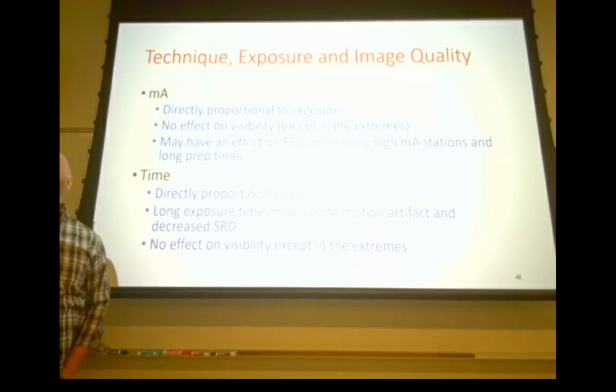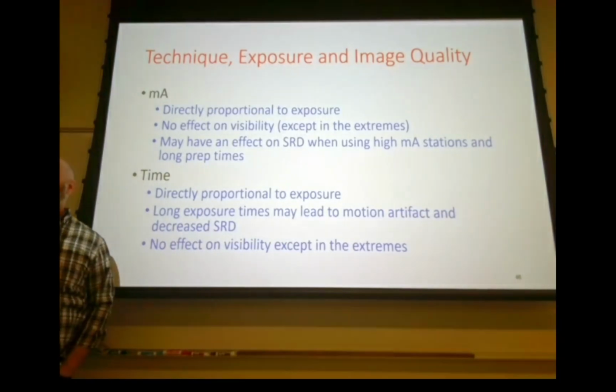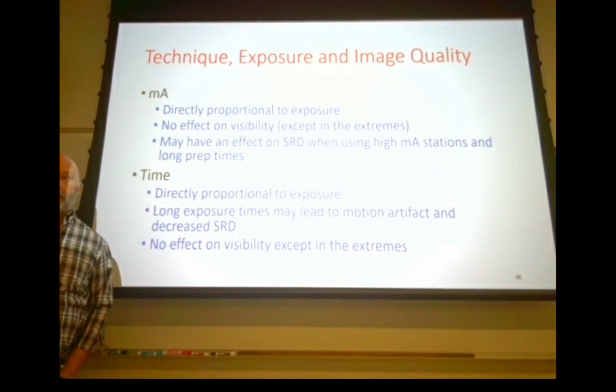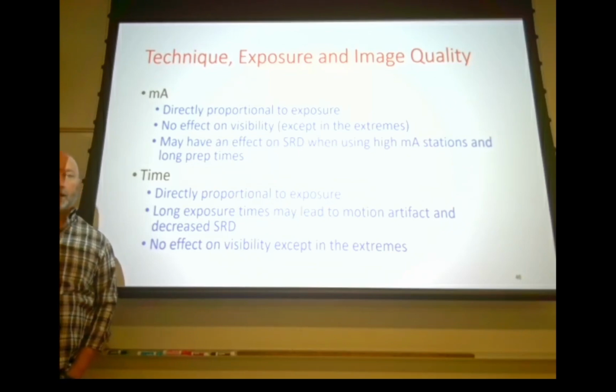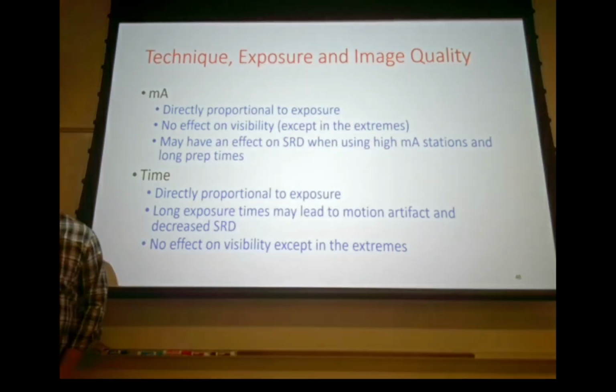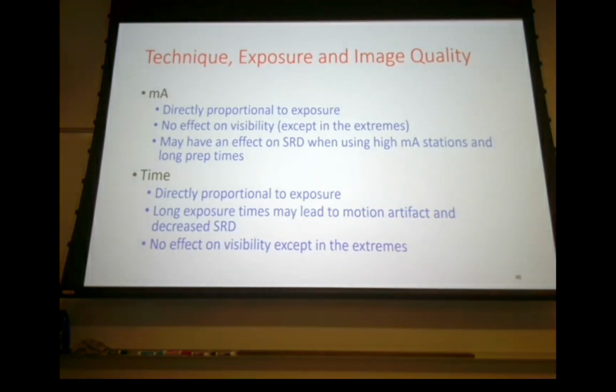You can give them good instructions. I mean, you can tape them down if you want to, but if they're moving, they're moving, right? Pigostats, great for holding kids, and I used to use them until I had one almost come out of the pigostat and fly out backwards. Yeah, he was strong, and he wasn't having any part of it. He started rocking that thing, that little leather strap across the back snapped loose. It didn't break it. It snapped loose, so now he's hanging out of this thing backwards. Never used another one, because I'm just not having a 2-year-old land on his head on the floor.